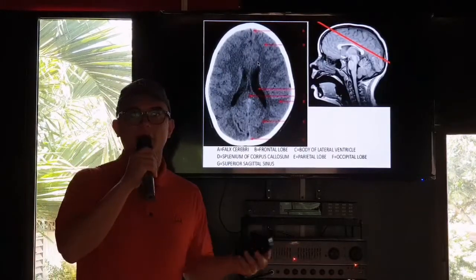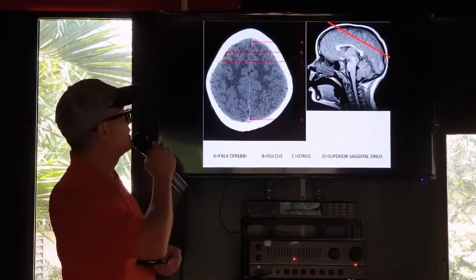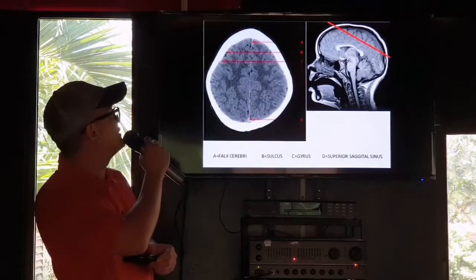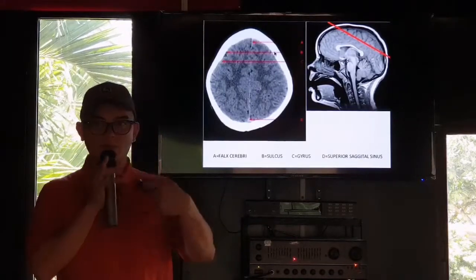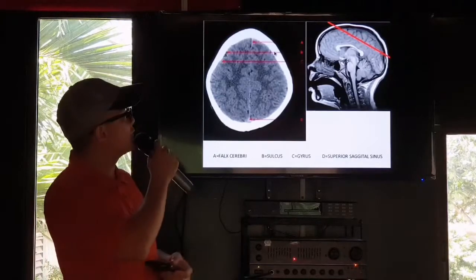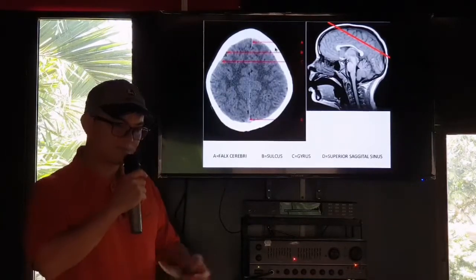And this is characteristic of a soft tissue window. If it's a bone window, you will see mostly the brain is a very fine gray and you will see more detail in the bone. You can even delineate the two tables of the skull bones, the outer and inner table, and of course, between them, the diploic bone, the diploe.